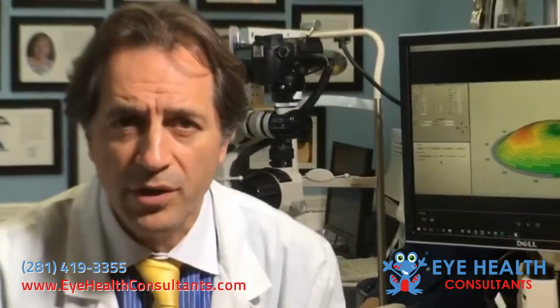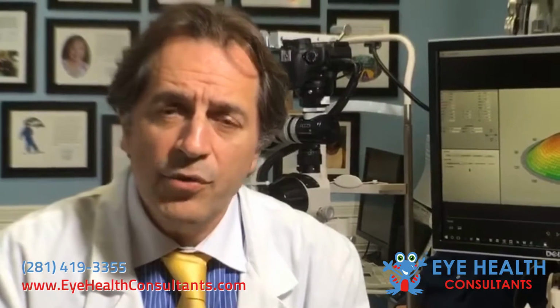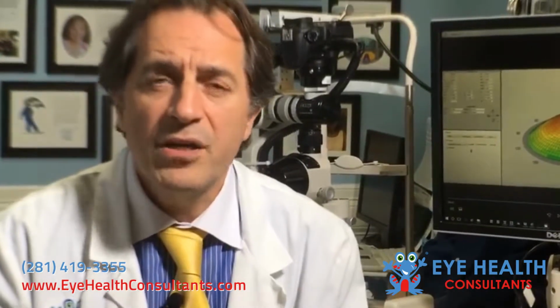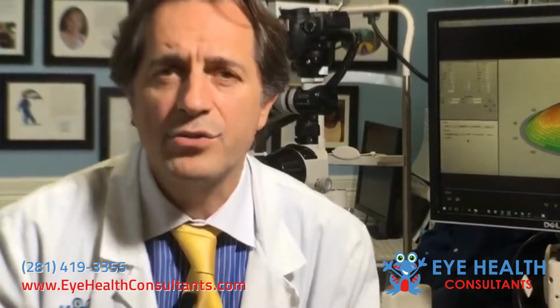Again, we take a history, we want to know about the patient's eyes, we take a refractive status of the eye, we check the visual acuities of course, we check their glasses to see what they're actually wearing. If they wear contacts, we want to know what contacts they're wearing, for how long. Clearly we need to know if the corneas are healthy. And for that, very importantly, we need to take a blueprint of the cornea that gives us information about the topographic map of curvatures in 3D actually, because that information we're going to use to elaborate the custom mold that will actually reshape the cornea while you sleep.